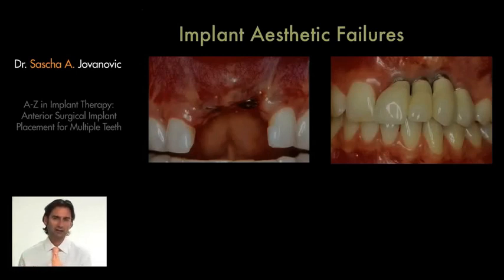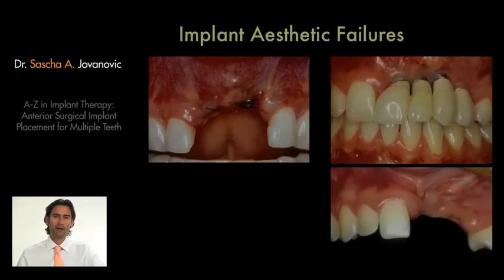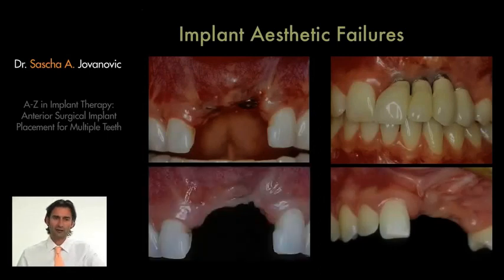To counter these failures, and unfortunately I see quite a few of those in my practice in Los Angeles, we sometimes have to go to extreme measures by removing these implants and then going back to the original level of the ridge. You can see here that we have removed the implants through a surgical procedure. We have now taken off the bridge, and we have to start over again.